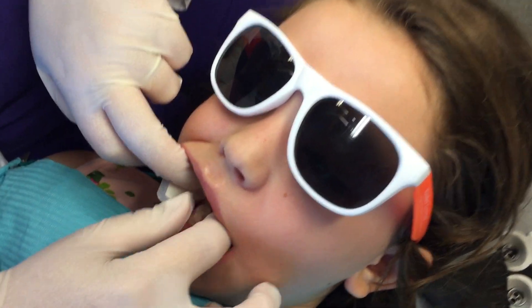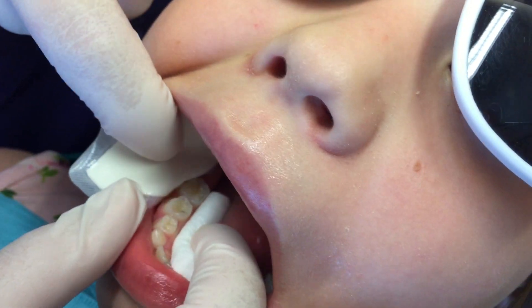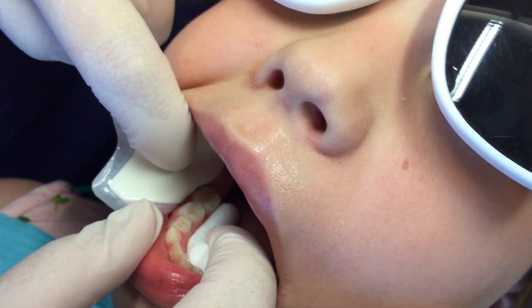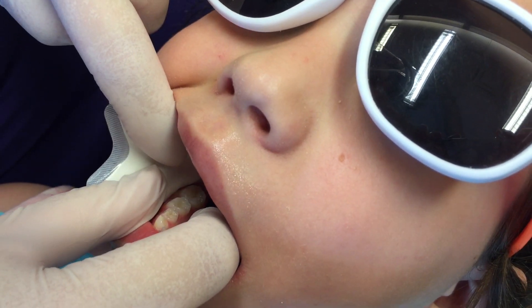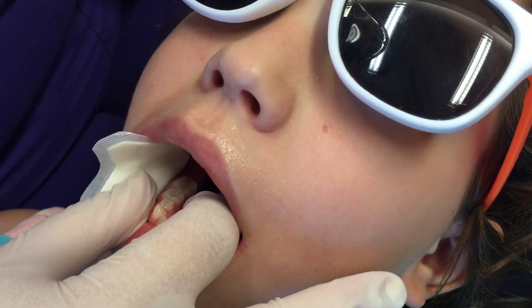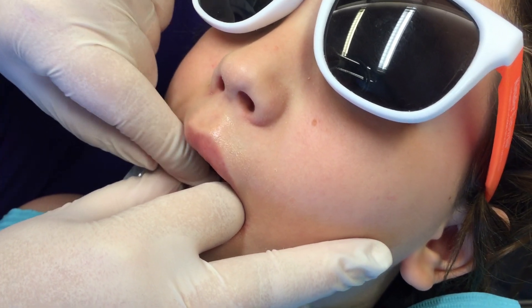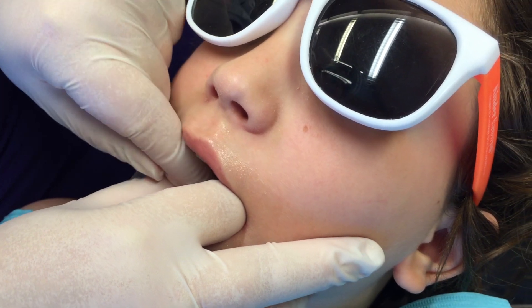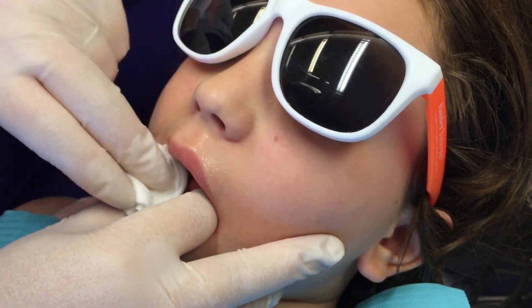See that little spot on the occlusal? On the occlusal of her primary second molar you can see that little groove where she's had SDF treatment a number of times. So we're going to now dry it off. We're not using compressed air, so you can use cotton to dry it — cotton roll or gauze.